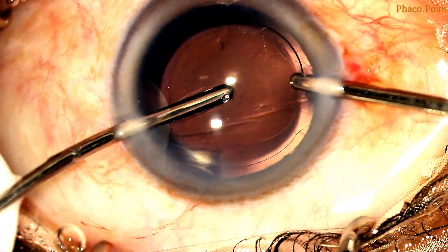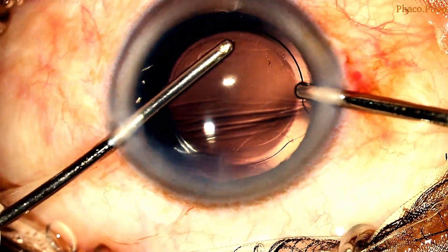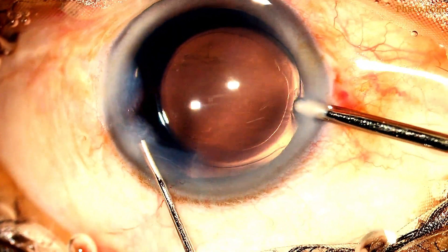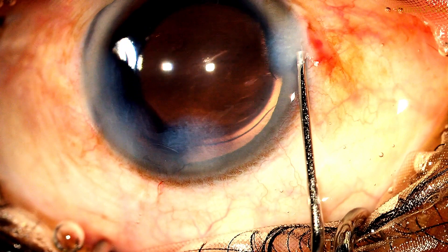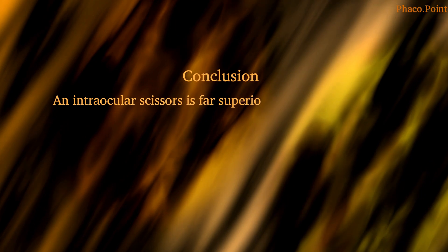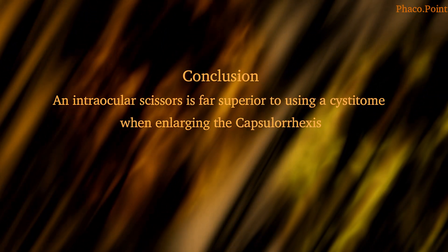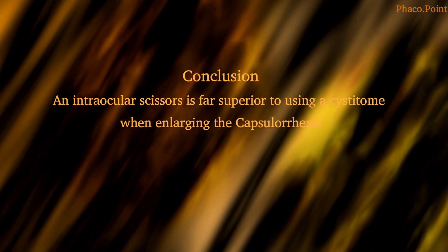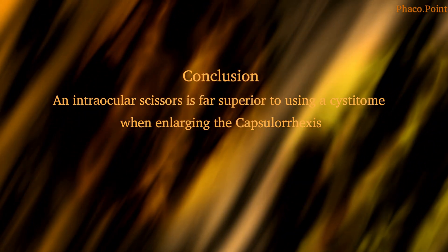During and at the end of irrigation aspiration, you can see quite clearly that you've been able to achieve the capsular RHEXIS of the size desired. Towards the end of the case, you can see the suitably enlarged RHEXIS. It has been my observation and experience that the use of an intraocular scissors, as opposed to the cystotome, is way superior and is the more controlled manner in which you will be able to very successfully enlarge a RHEXIS to the size actually desired.